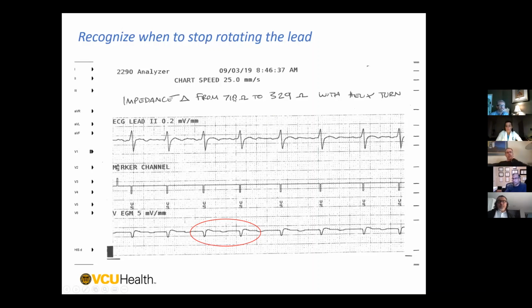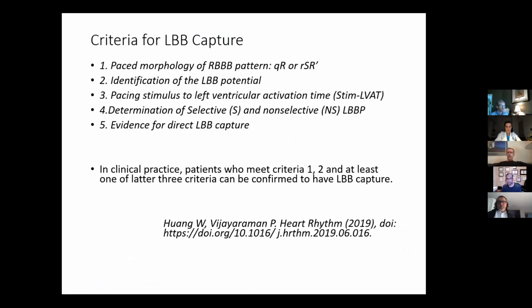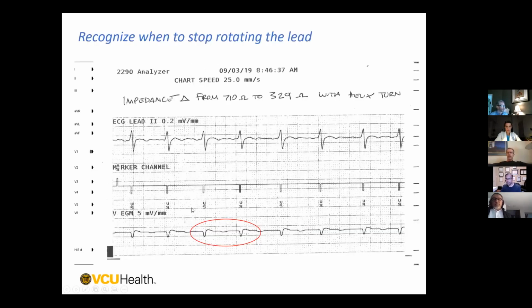It's not necessarily going to halve like this, where it goes from 700 to 300. But the change in impedance, the drop in impedance, is another indicator that you've hit the right spot. Well, he's hit the left ventricle, though, I think, hasn't he? Well, I was also saying the polarity change.